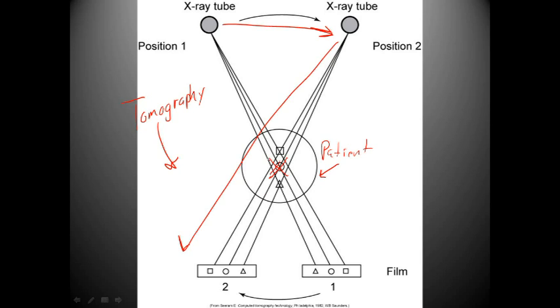Basically, this area here, or the fulcrum, is where the X-ray tube and the film pivot, and you want it in the center of the anatomy that you want to view. As you can see here, the problem with this is everyone's anatomy is different. So how can you guarantee that on the first try you're actually going to get it? That would mean that multiple times you would probably have to shoot this image to see if you can actually acquire what you're shooting for and striving for.